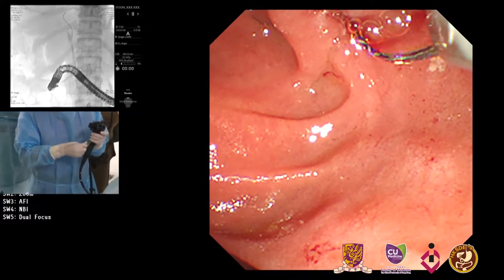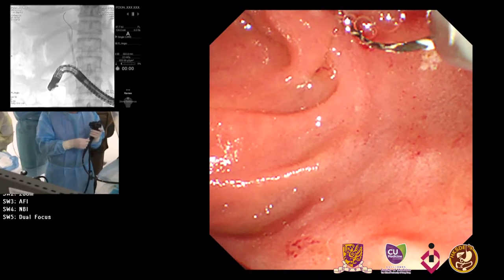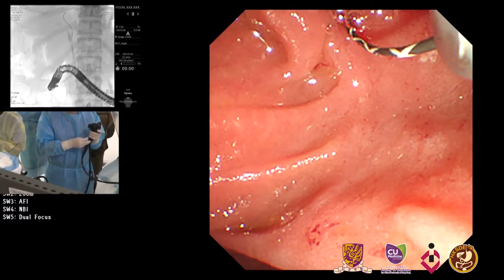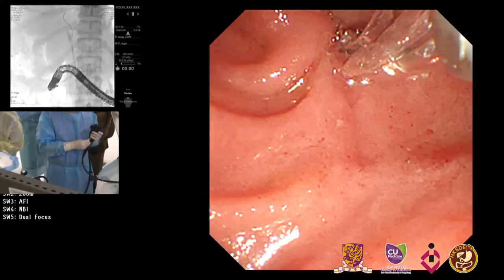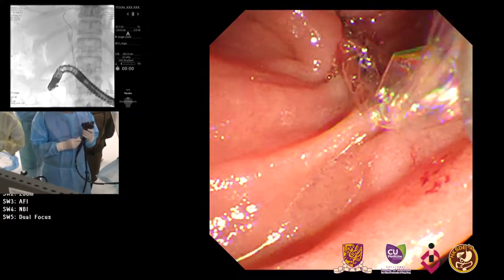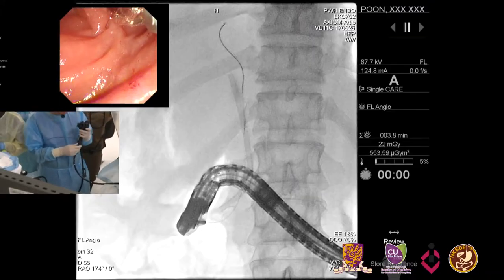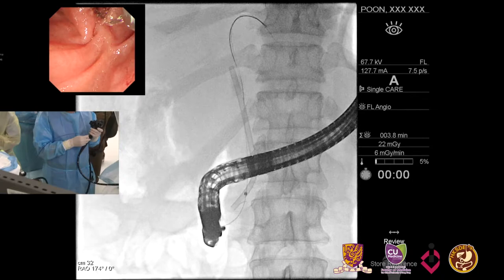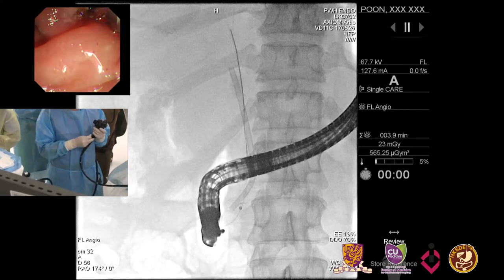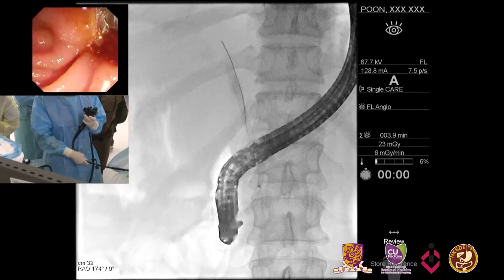You haven't really demonstrated a stricture. It looks like a mid CBD. Now the balloon dilation. Is this a 5.5 millimeter? I mean centimeter, right? So you have to be very careful not to go up to the stricture site. You know, this balloon now comes in a 3 centimeter length, so that would have been a better choice here, or a 3 centimeter Max dilator. Like the CRE, the biliary CRE, now it comes in 3 centimeter length. And of course, the Hurricane is 4 centimeter.